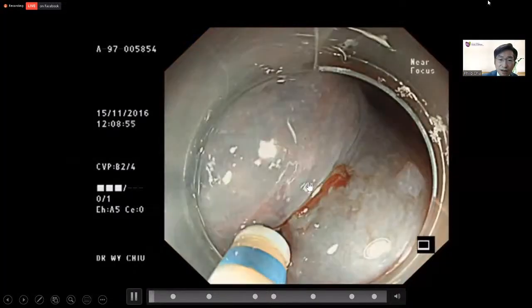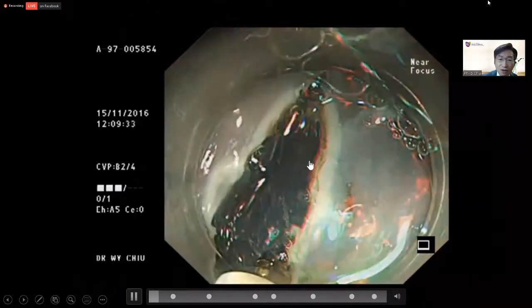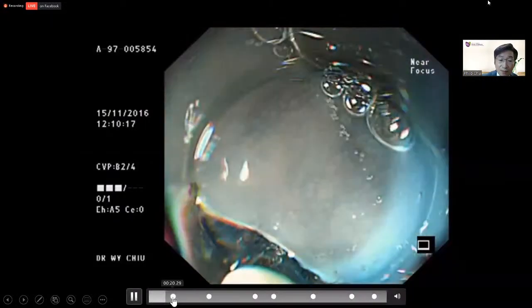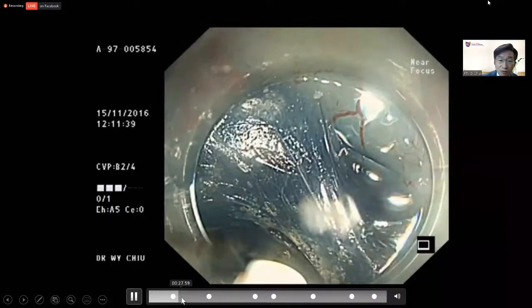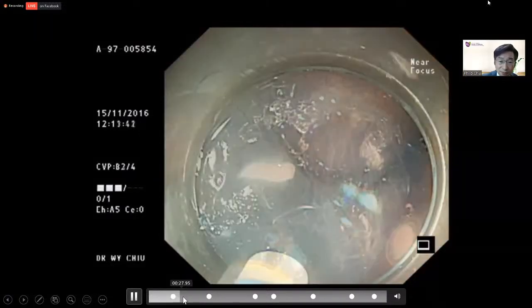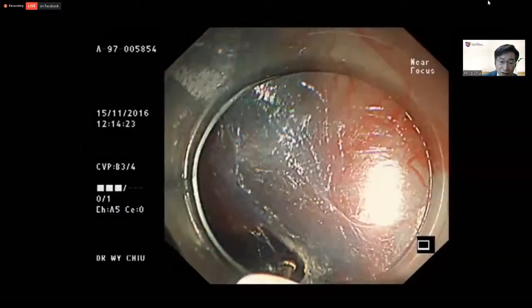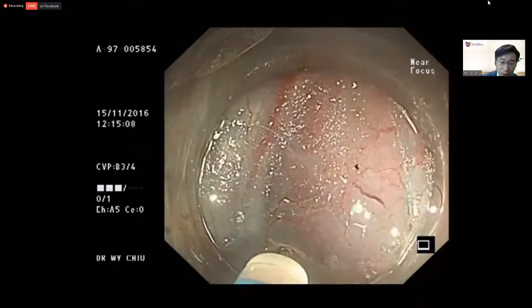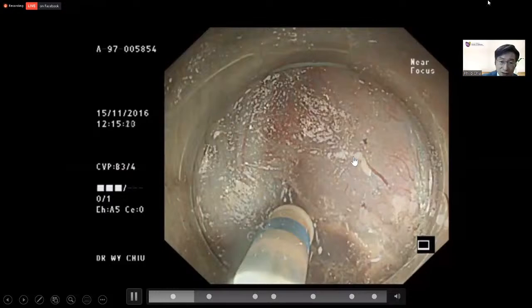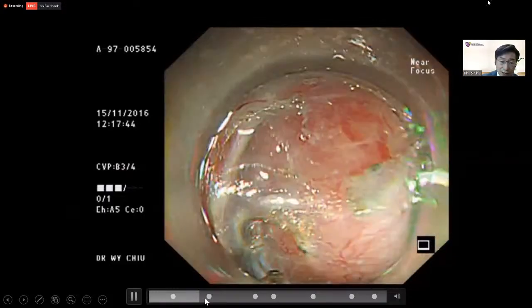So it is an esophageal leiomyoma, and we developed the submucosal tunnel 2 centimeters proximal to the tumor, the same as the POEM. Then after dissection of the tunnel, we will be able to reach the submucosal tumor. After reaching the submucosal tumor, we continue the dissection around the tumor to ensure that we have a good border of dissection. So this is the submucosal tumor while it is adherent to the muscularis propria layer.